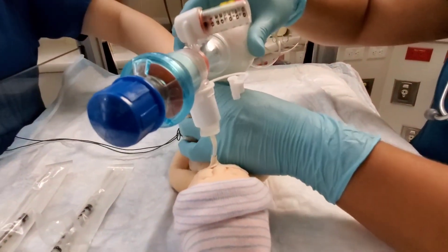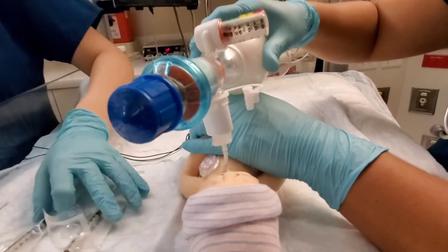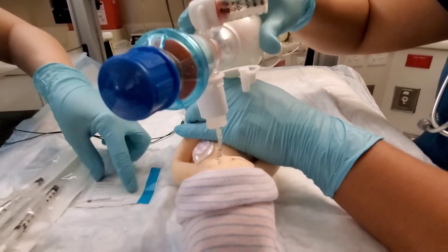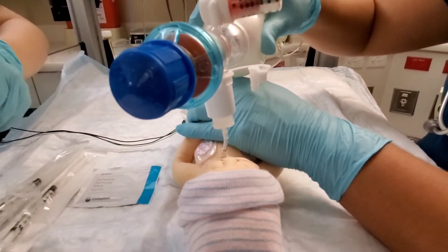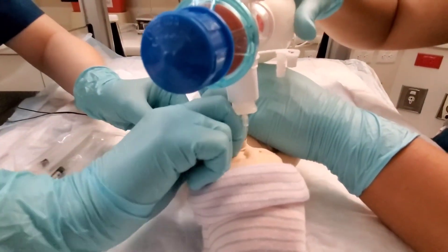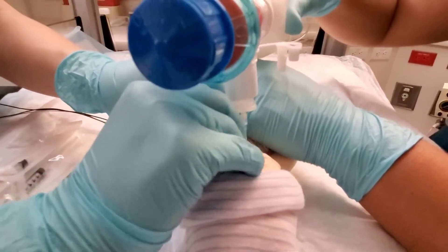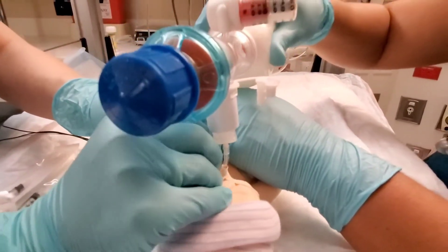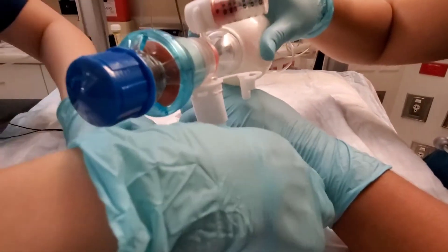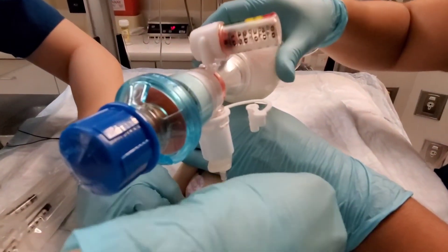So if for whatever reason we decided we want to extubate the baby and put the baby on CPAP, what we would do is take a pad to help get the tape off. So we'll take the tape off using a remover. Notice how when one caregiver shifted jobs, the other caregiver maintained that infant in a fetal flex position, allowing the other caregiver to have both hands free.